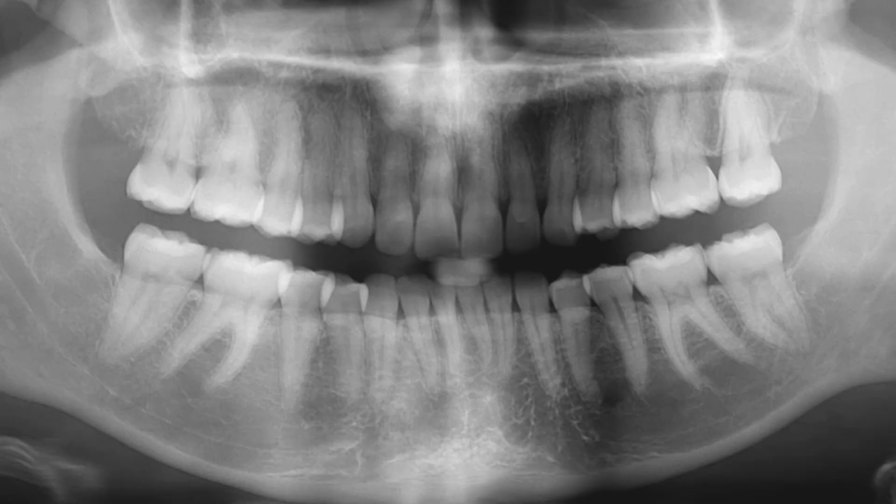When we look at the patient's radiograph, we see that she has a full complement of teeth. The third molars, or the wisdom teeth, are gone at this point. But please note the biting surface of the patient's teeth. If you look at the back teeth in particular, the surfaces are very flat, unusually flat for the patient's age. And this is, again, due to the unusually high bite forces, clenching habits that the patient possesses.